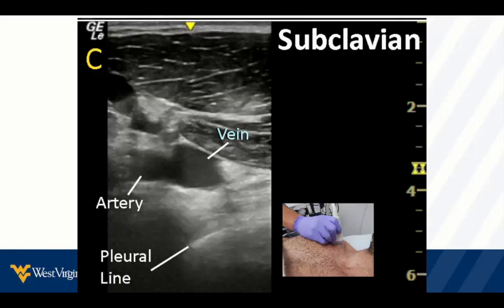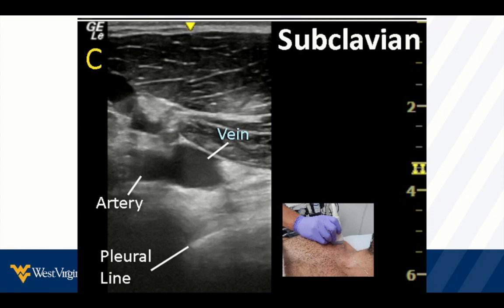Once we've followed the brachial veins all the way up the arm and found the axillary veins — making sure they're compressible — we look for the subclavian vein. The way I like to do this is place the probe transecting the clavicle, indicator towards about 12 o'clock towards the wall with the patient lying flat. As I slide below the clavicle and follow from the axilla to the neck, I should find the artery and vein somewhere along there. The vein is usually a little more superficial and bigger than the artery. In some patients it may be spontaneously collapsed — if all you find is the artery and the vein is collapsed, that's a normal vein. You can have the patient valsalva or lie them flat to help distend the vein.